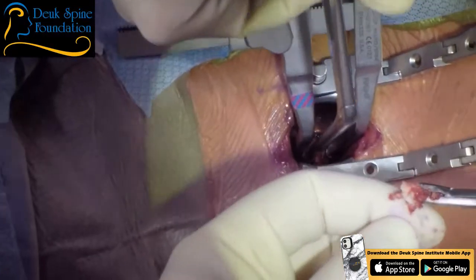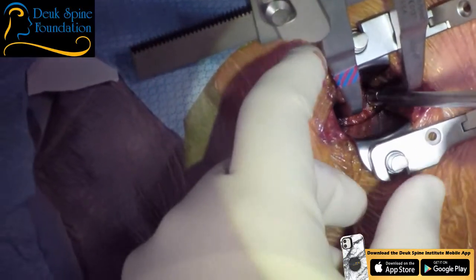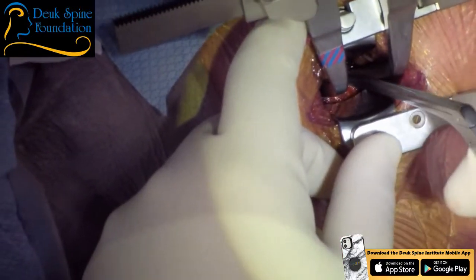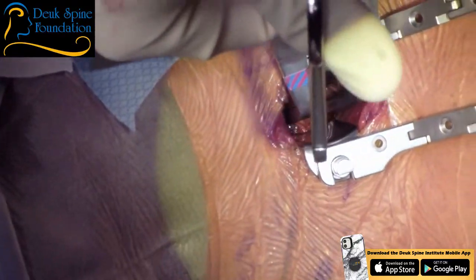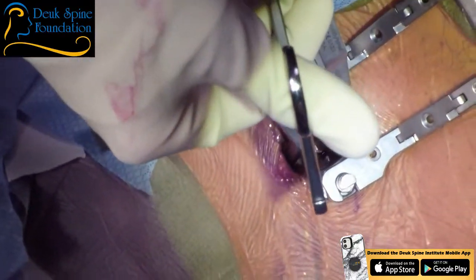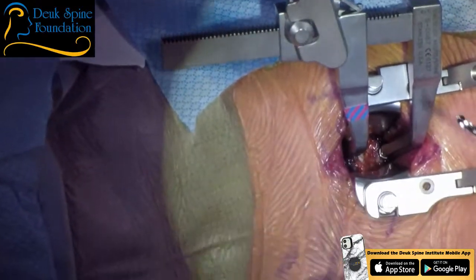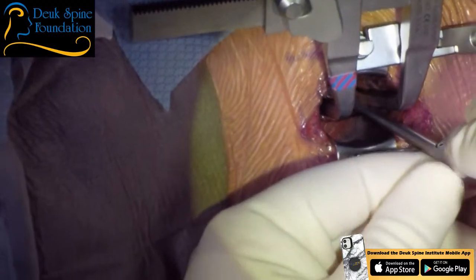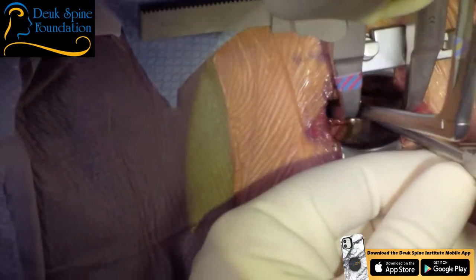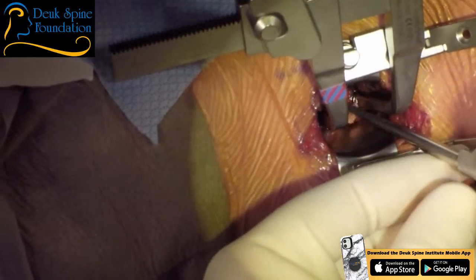All right, so this disc is fractured right off the bone. Wipe. Dr. Patel, you should have the pituitary. I should have the curette. Okay. Wipe. So send that disc material. Here you go. Thank you. Let me have a scraper, number 5. So I use a Codman curette, best in the world. If you do this kind of surgery in your future, or you do it now, don't substitute. The Codman is unsubstitutable.